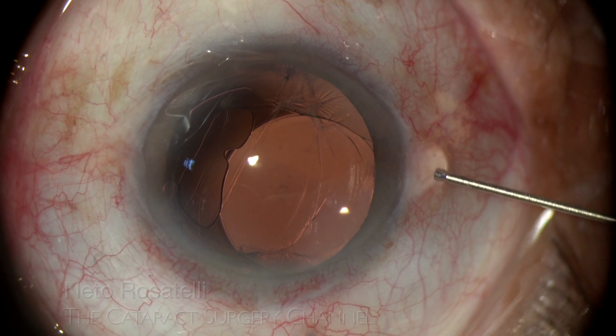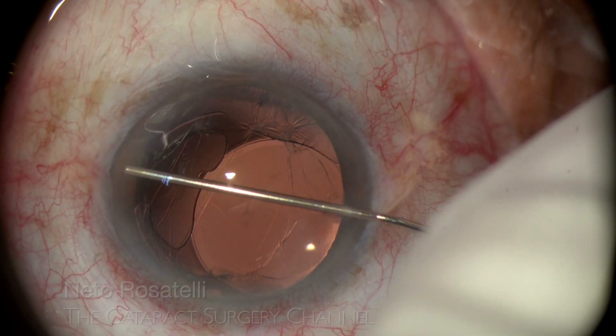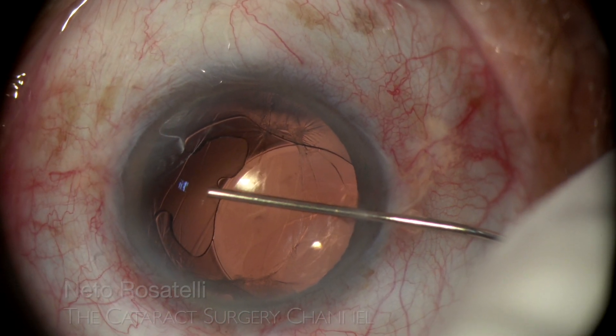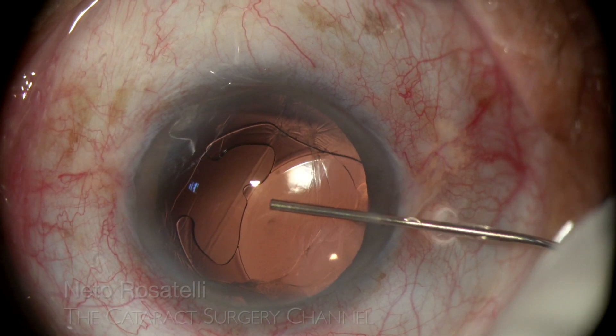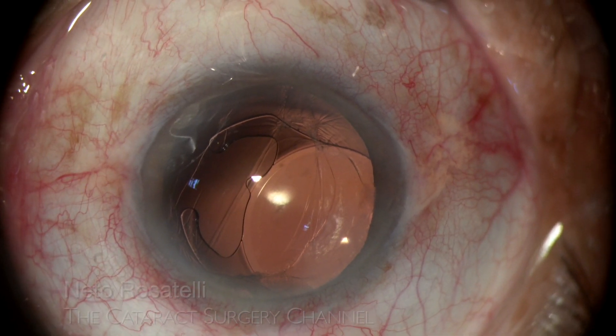After that, dispersive OVD is carefully injected forming a wave to completely fill the anterior chamber, ensuring good endothelial protection and providing space to safely maneuver the IOL.